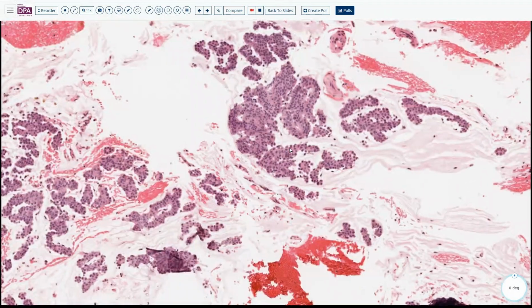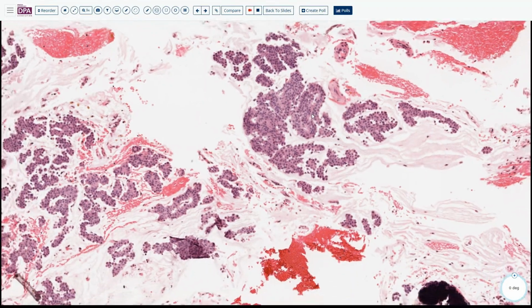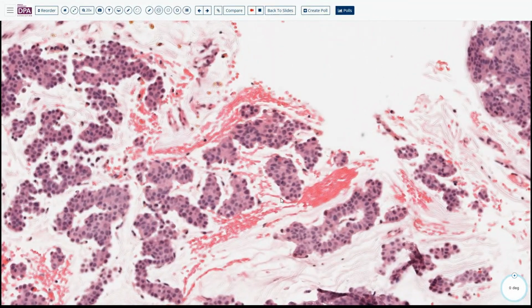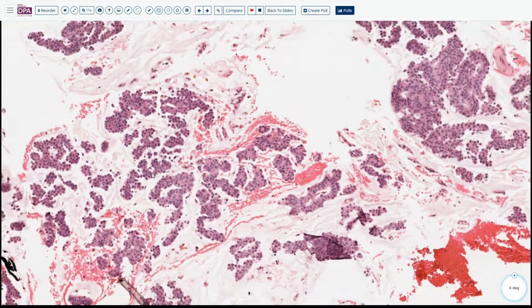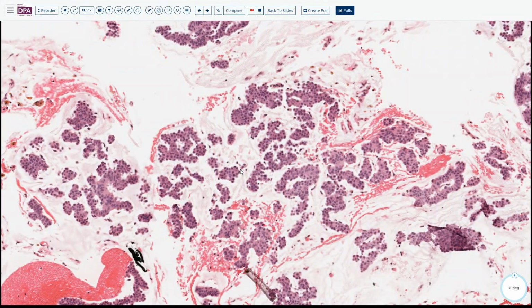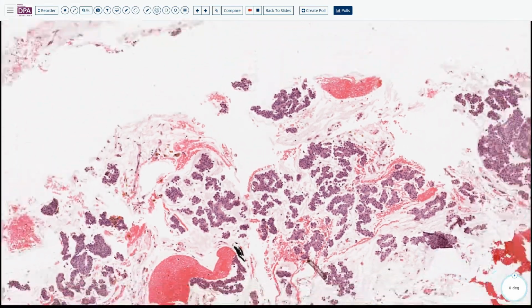Another point: even if this is a surgical pathology sample, you still need to grade the nuclei. If you see really pleomorphic cells, tons of mitoses, really high-grade features, you also cannot call this mucinous carcinoma, because by definition mucinous carcinoma should have low-grade nuclear features like this one.